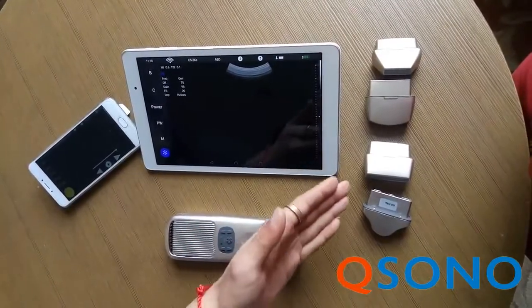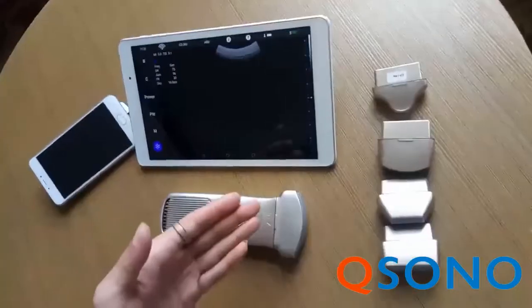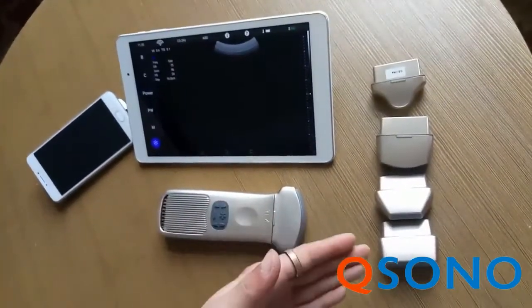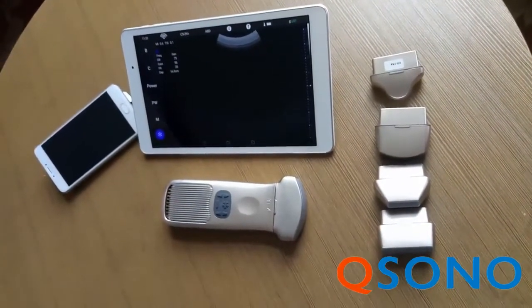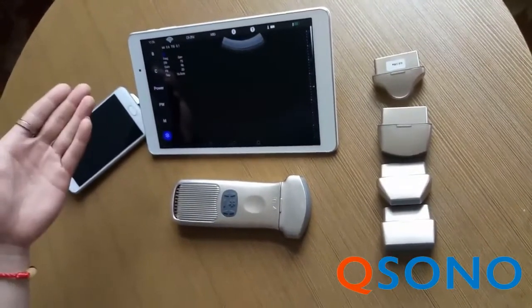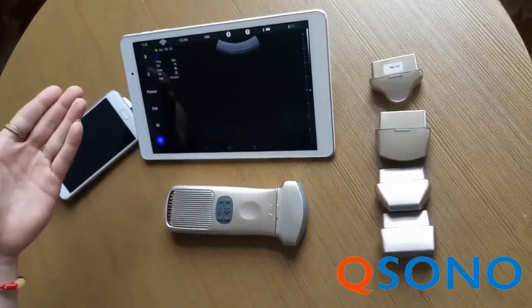There are various probe options available. We can support convex probe, linear probe, micro-convex probe, and transvaginal probe, etc. And it can support color Doppler, pulse wave Doppler, power Doppler, etc.